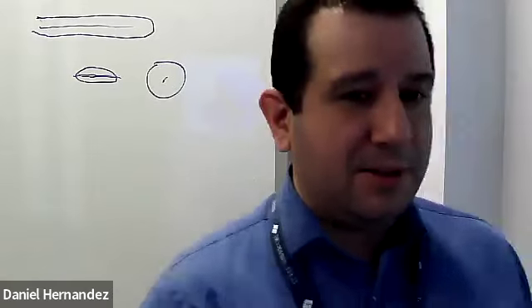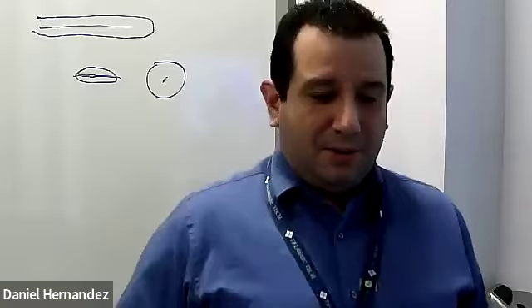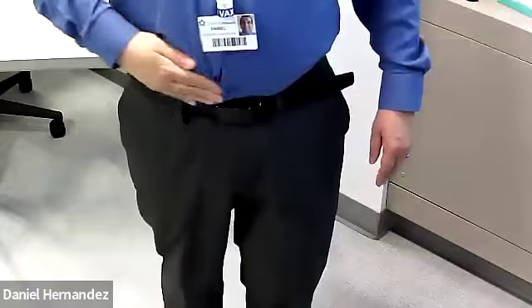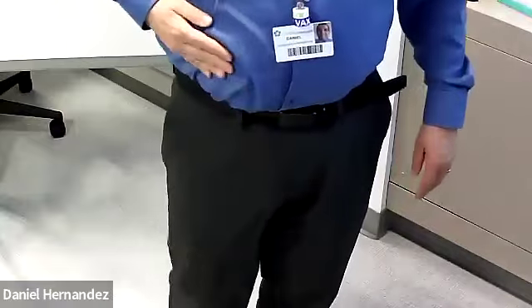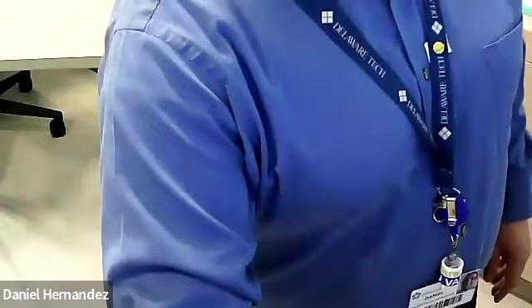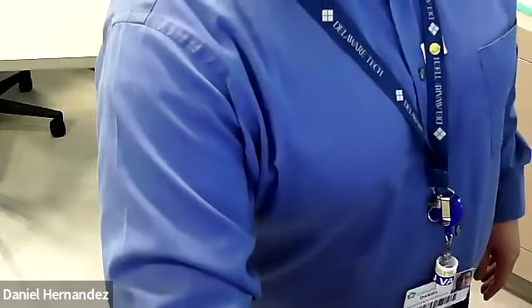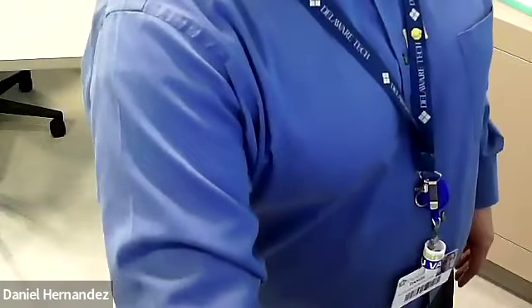Then another view. So this one now, the appendix distal tip, instead of being more central, more medial, so that's usually how they run. Usually, the appendix will come off the cecum and then extend more medial and more down. This one actually comes out more towards the side. So the tip is actually more lateral where it comes off. So it comes off and maybe loops back and goes lateral now.